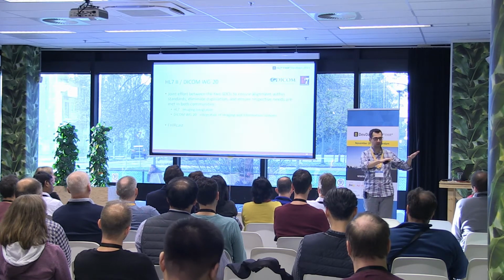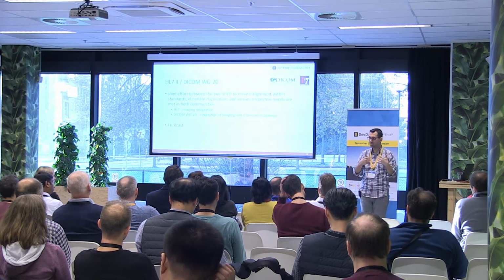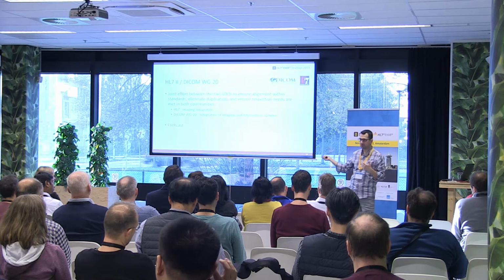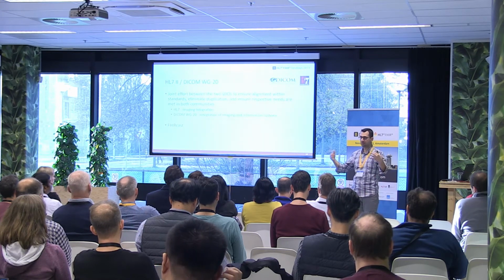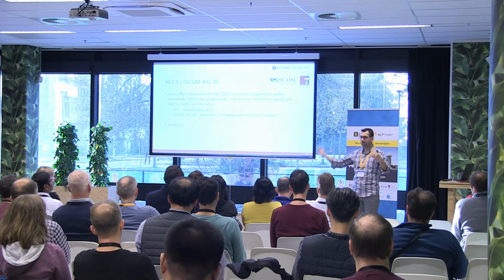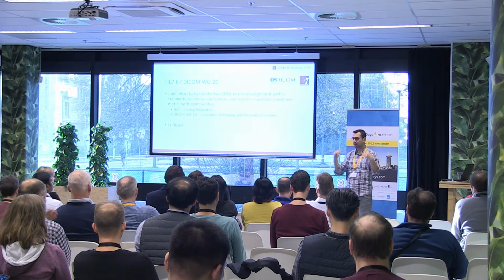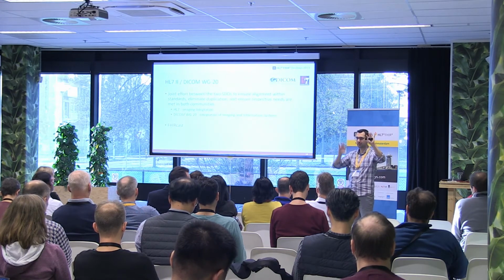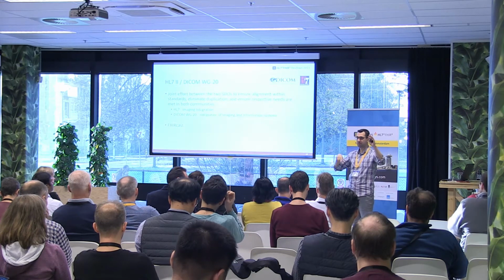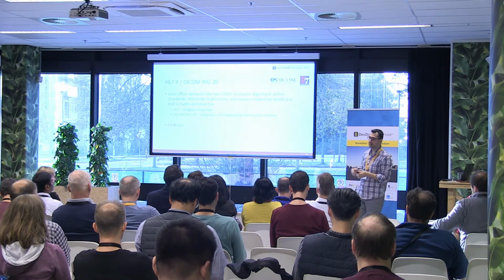So think about it, multiple applications on a PC that need to talk to each other. That's what FHIRcast is actually trying to solve. So most people, when they think about integrations, they're thinking about back-end integrations, pushing information server to server. This is different. This is actually on the workstation. If you've ever seen a doctor work, they usually have multiple clinical applications open. These applications need to talk to each other so they're all synchronized on the same page. That's what FHIRcast is doing.